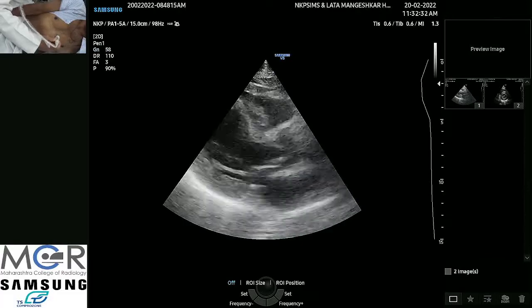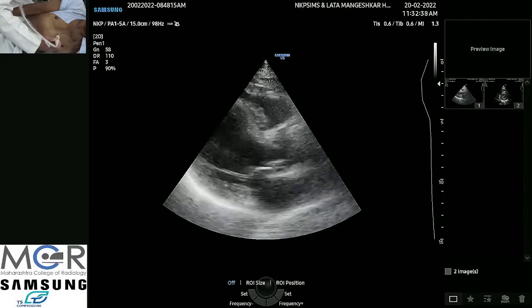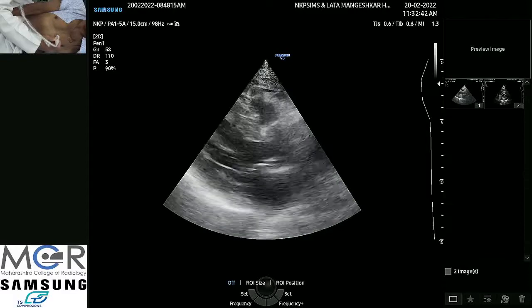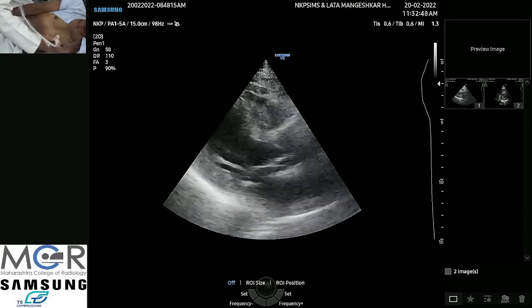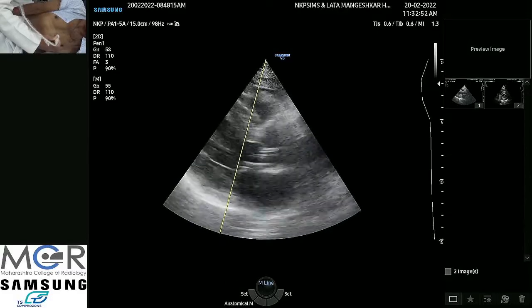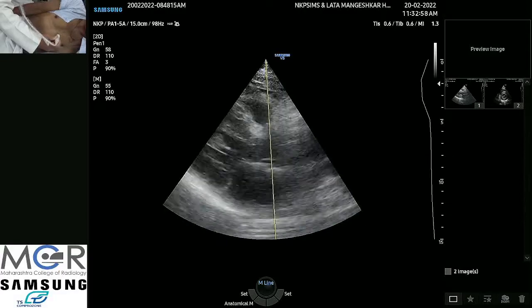I started my career way back in 1981 in echocardiography, and at that time only M mode was available. I spent a lot of years, about 4 or 5 years, in M mode echocardiography only. So I still like that methodology, so let us start with that. So this is the M mode cursor. As I told you, this cursor you can keep at the aortic valve.